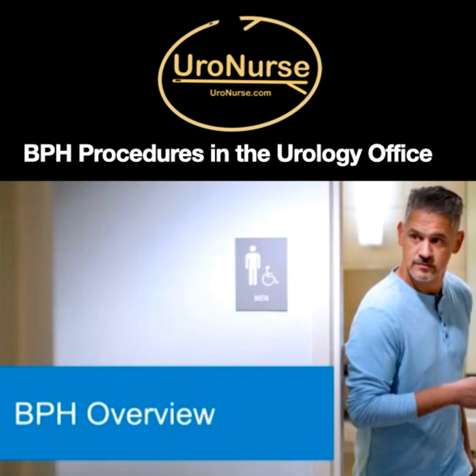This procedure is a bit longer. It's a little bit more torquing on the prostate. It's a bit more of a test of your prostate block and the nitrous. So I think you have to warn them of that. The beauty about the Rezum, they're just 9-second treatments, and it's typically 4 to 7 treatments. 4 or 5 is sort of my average, I would say. And so the Urolift is going to be a few minutes longer, a few minutes more discomfort.